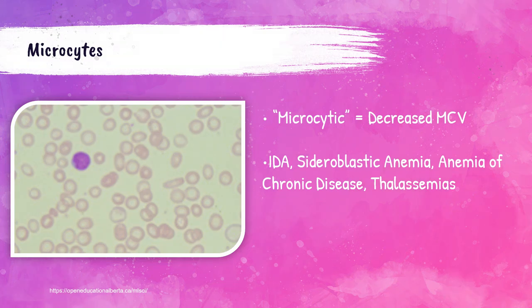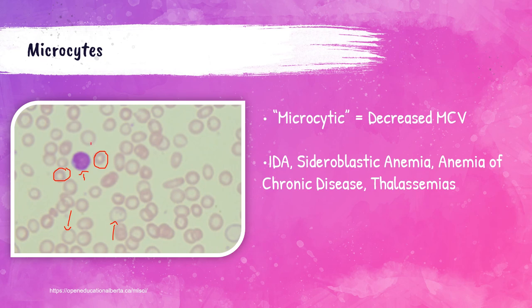These are what we call microcytes. For example, this is a microcyte — not all of these are microcytes; this here is a white blood cell called a lymphocyte. When I talk about microcytes, I'm referring to the size of the red blood cell. This patient has a low MCV index, and also probably a decreased MCHC as well. If you look at these red blood cells, they're of course small — so they are considered microcytes — but they also have an increased central pallor, so they probably have a decreased MCHC.